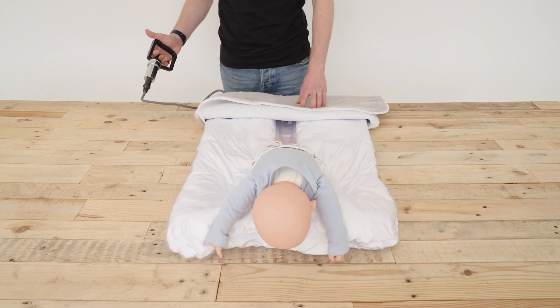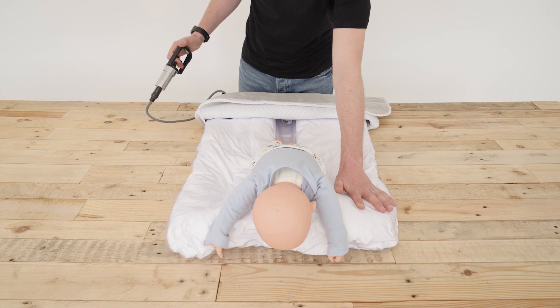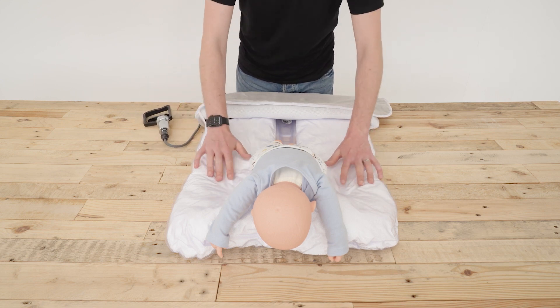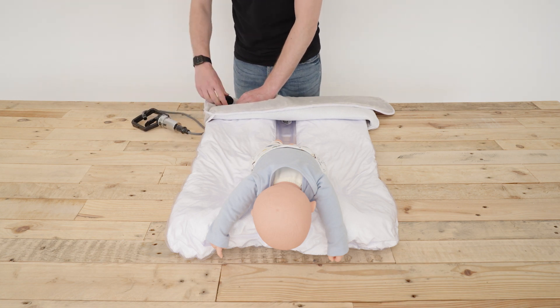Once the required position has been achieved, use the pump to remove air from the base cushion to the desired level of firmness. The surface should be firm but comfortable for the infant. Detach the pump and close the cap.